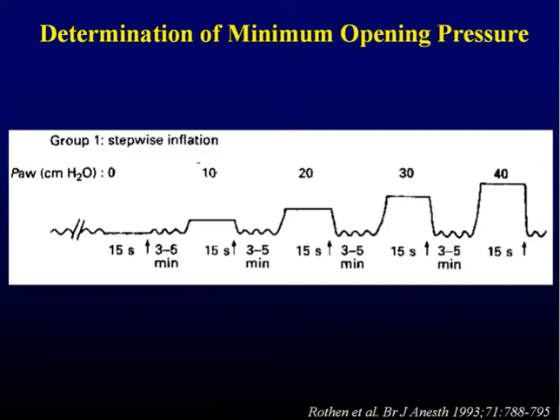They were studied with CT scans just after induction of anesthesia. And they made a stepwise inflation with 15 seconds of every pressure level with basal ventilation in between, and all the arrows are indicating CT scans that were performed, seeing how the atelectasis were evolving with the different pressure applied.